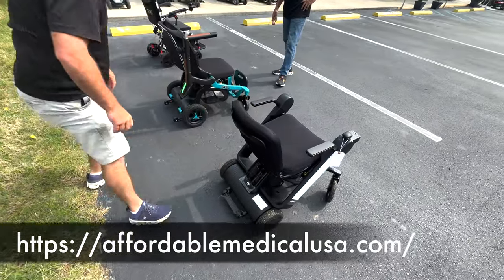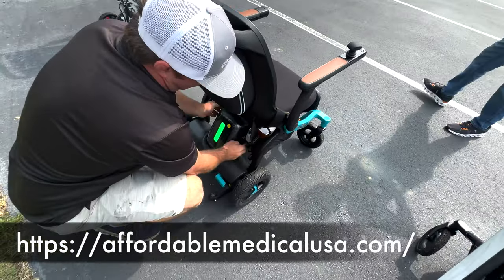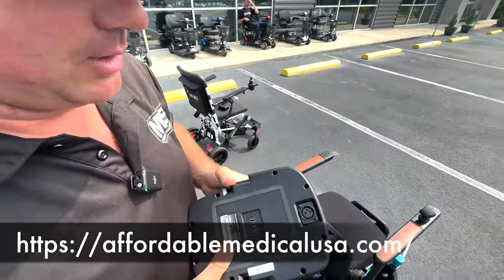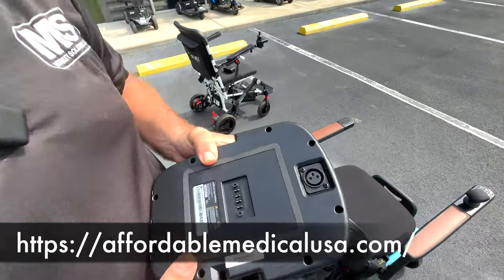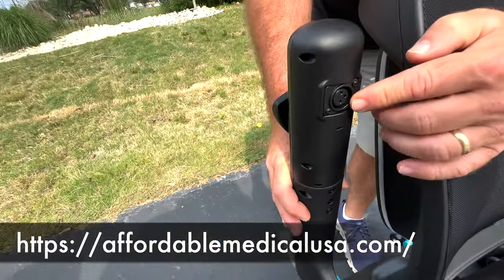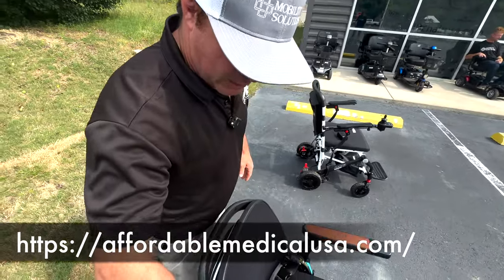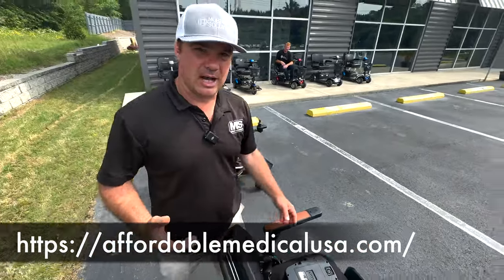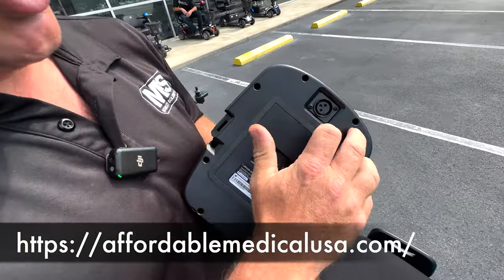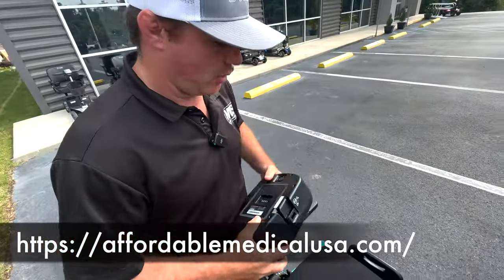The battery over here on the alley, about the same. I like the handle on that. You can charge it through here, but the benefit you'd get is you can also charge it directly through the joystick. So if you're using this inside your house, if you live at independent living and you need to charge it, it's easily charged through here. Or if you're traveling a lot and you don't want to take the chair inside, you could take just this battery pack inside and charge it through here. This is a 20 amp hour battery. This is the long range battery they have at the moment.